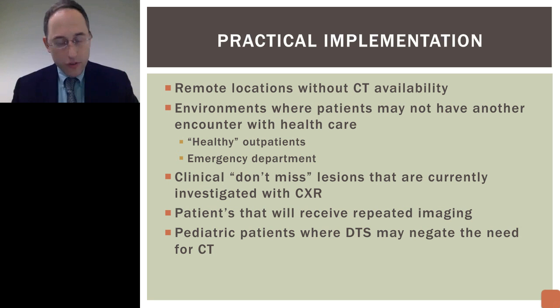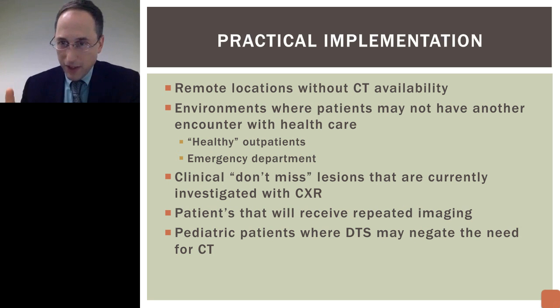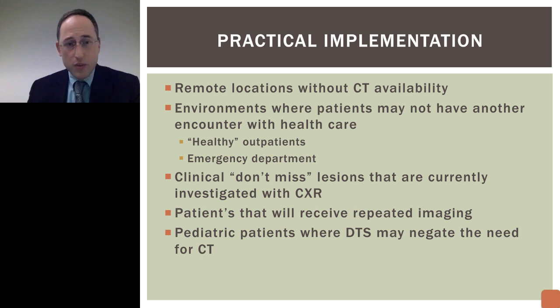What is my personal view of how implementation of tomosynthesis works? And I do want to preface this by saying I don't have any specific evidence behind this, but it's basically just my understanding of the evidence that is present, my own experience, and what seems logical. I think tomosynthesis would make a lot of sense in remote locations that cannot have a CT for whatever reason, but have chest radiography. It may make sense for those locations to have tomosynthesis so that you have cross-sectional imaging on site for those patients.